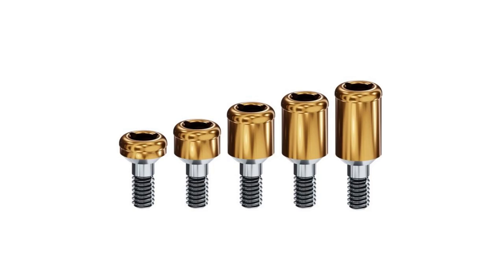Once the implants were healed, they were uncovered and had locator post attachments placed on them. While the implants were healing, I made him a set of upper and lower immediate dentures. These are made out of all plastic and don't have the metal framework inside them. They are also as large as conventional dentures, meaning that the upper denture covers the roof of his mouth.